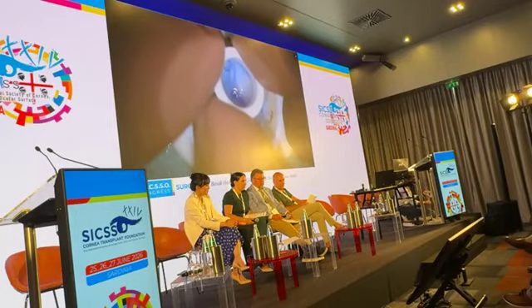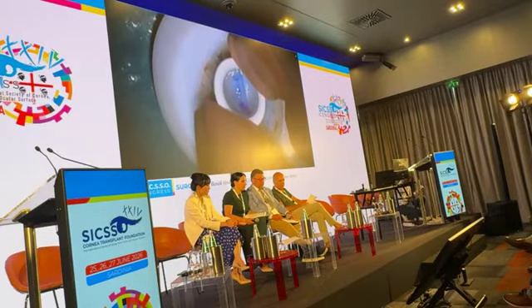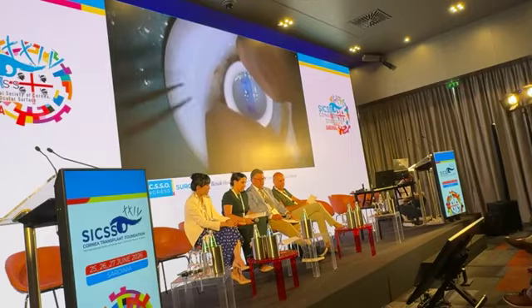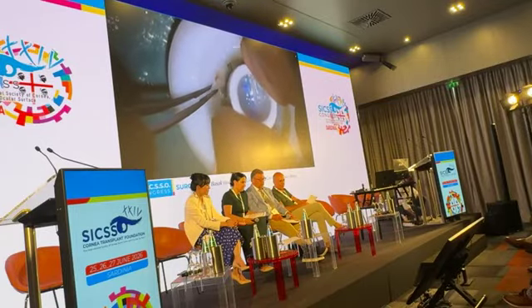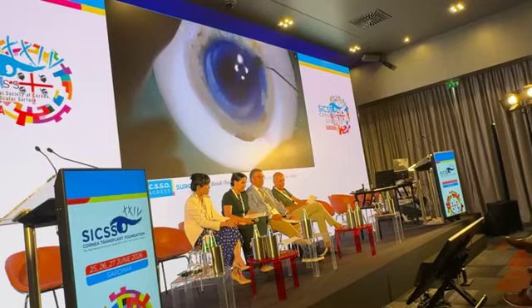This was more than 6 millimeter, which is the size that Dr. Bezek normally uses for deciding whether a PI is needed or not for a patient receiving a DMEK. When the pupil size after dilation is above 6 millimeter, he doesn't perform a PI. Otherwise, he does that intraoperatively, only in cases in which we do have a small pupil after dilation.